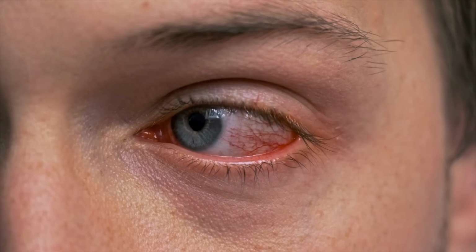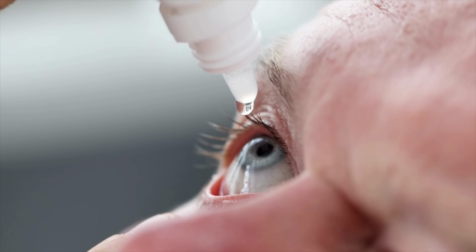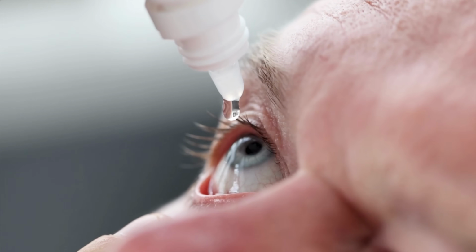But overall, the osmolarity, I believe, is an important test, mainly because if I have a patient who is symptomatic for dry eyes, but their osmolarity is normal, then I need to be thinking as a doctor, okay, this may not be dry eye. This could in fact be blepharitis, or maybe an allergy of some kind, or perhaps this is the second or third time we've done this and we've started you on a treatment and that treatment is starting to have an effect. We're seeing normal levels again. That's why osmolarity testing can be so helpful for dry eye.